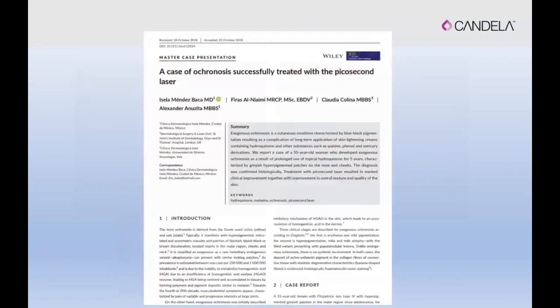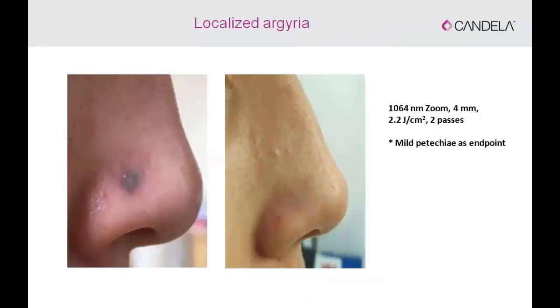And I'm pleased to say that we have submitted this and we have published this. This was a case that was treated with my colleagues from Mexico. I have another case that I have treated also in combination with the fractional CO2 with low density, low fluence pre-treatment with the fractional CO2, followed also by the PicoWay.